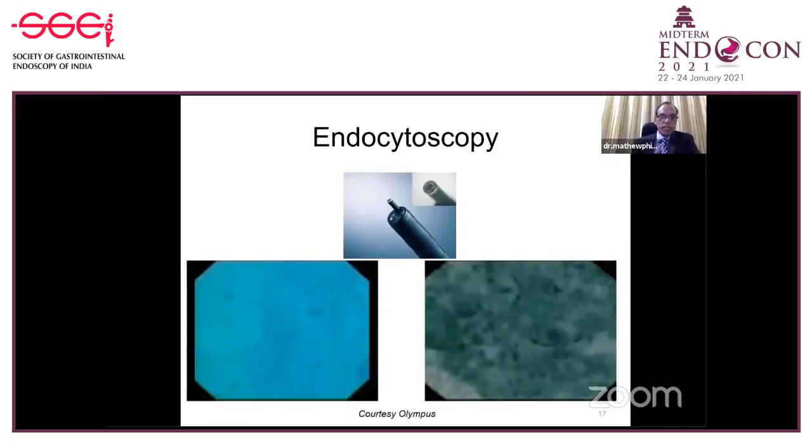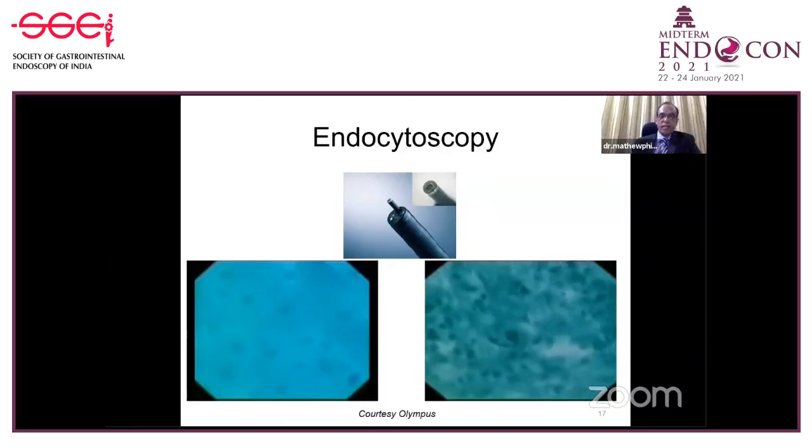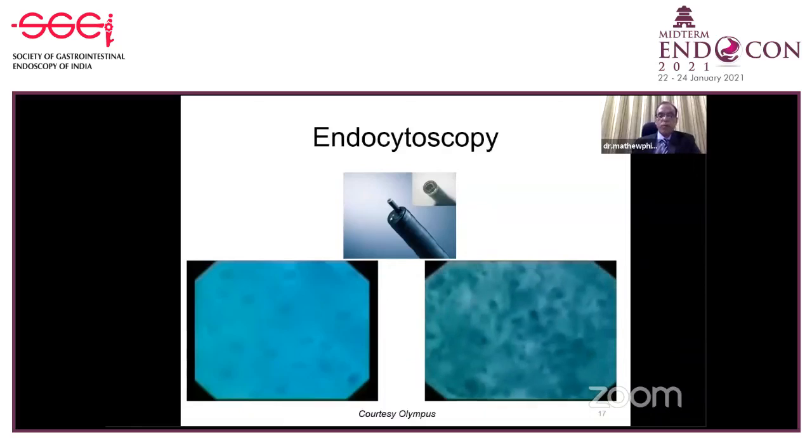This is an old generation video. You can see the squamous cell epithelium normal. Next. And now it is crowded nucleus seen there in the esophagus. That is suggestive of malignancy. That is actually an old one, and it's actually curated by Olympus. Next slide.